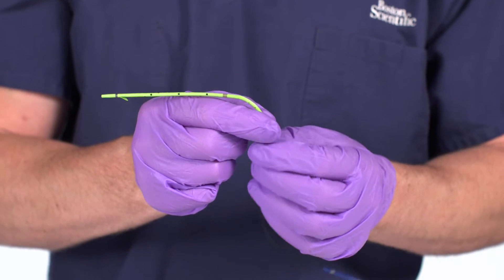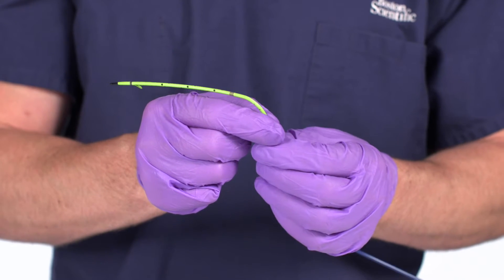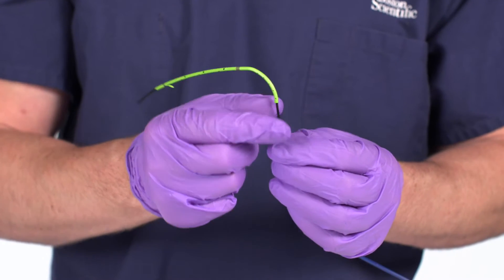Note: when using a straight stent, load the stent onto the guide catheter, trailing end first.